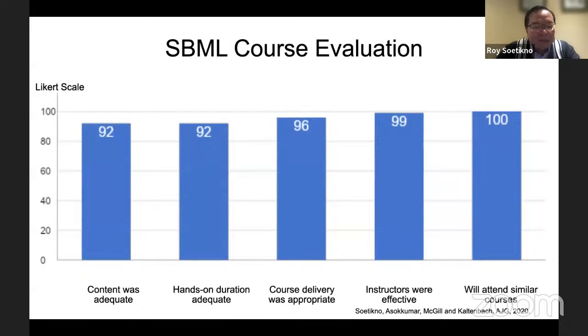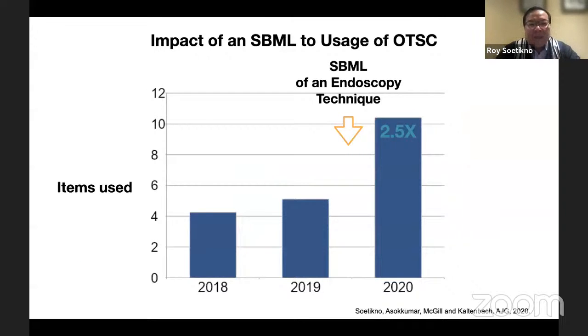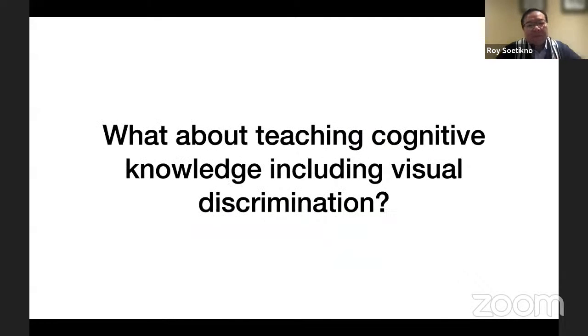The evaluations of the SBML course have usually been very, very good. And here we also have confirmed that the use of the knowledge tends to be sustained. Here we showed that the accessory, the over-the-scope clip, was used about 2.5 times more after a course in the unit in the United States.